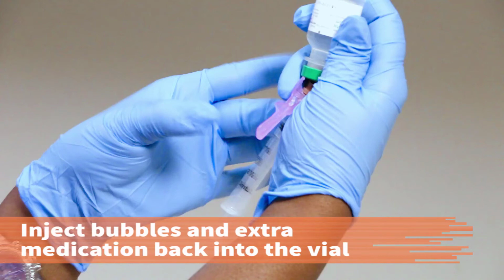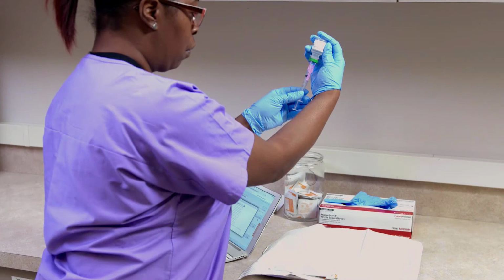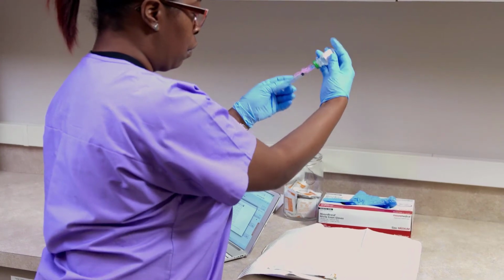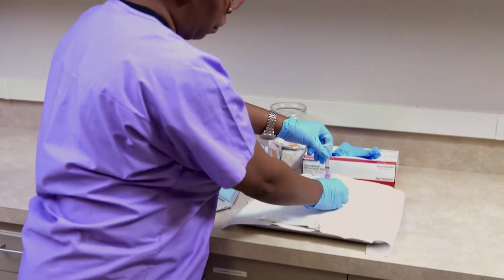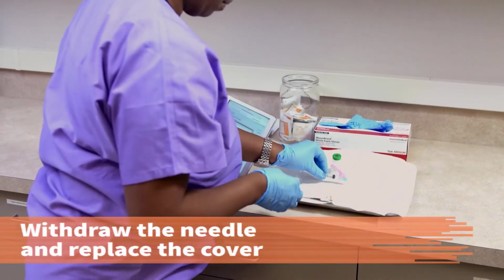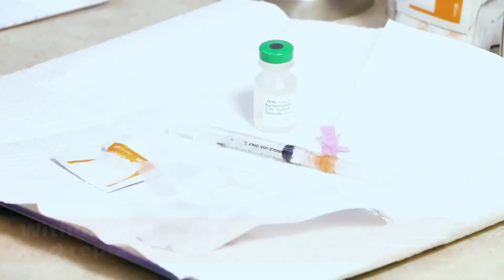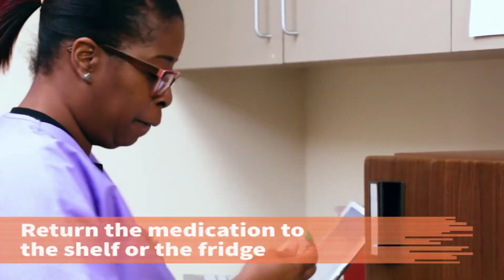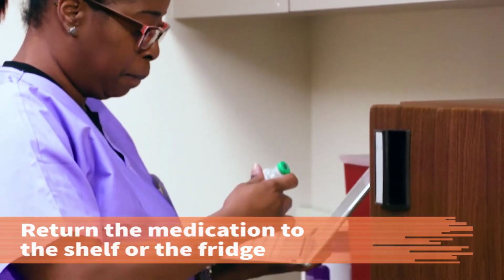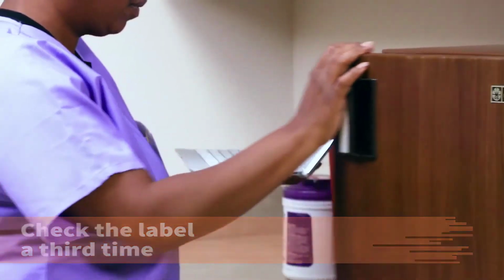Inject the air bubbles back into the vial with the extra medication that was withdrawn. At eye level, make sure the accurate amount of medication is in the syringe unit. Withdraw the needle from the vial and carefully replace the needle cover without letting the needle touch the outside of the cover. Return the medication to the shelf or the refrigerator, checking the order against the label one more time to complete all 3 label checks.